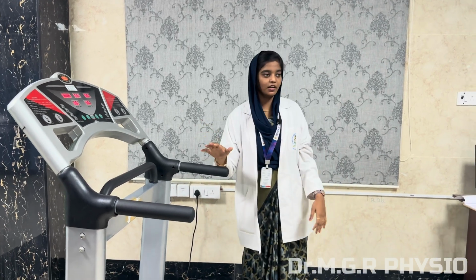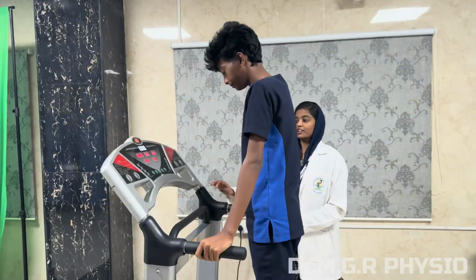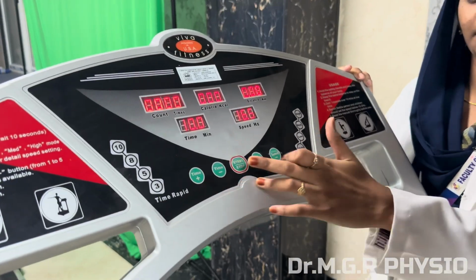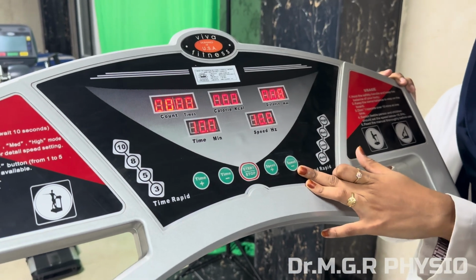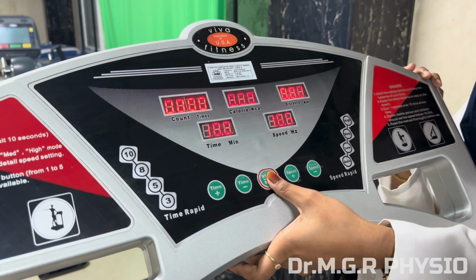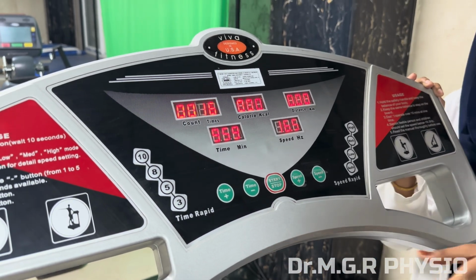Let's demonstrate how to use this machine. As we saw, we set all the required needs: the time and the speed according to our requirement, and then we start the program.